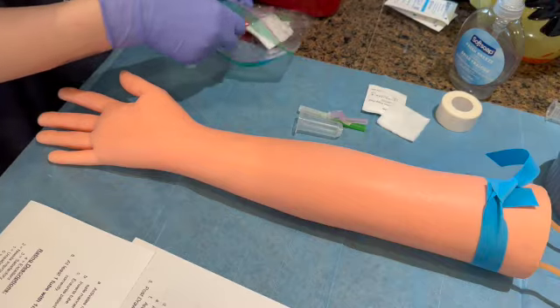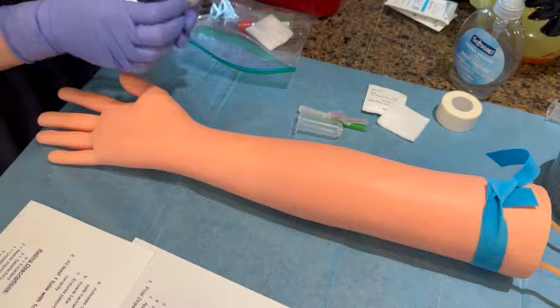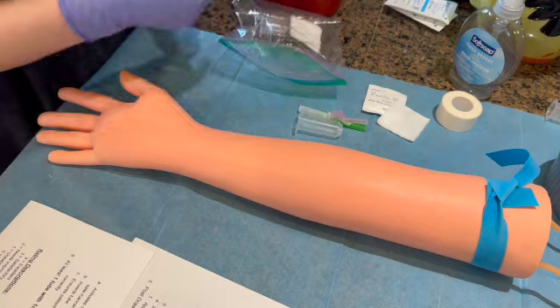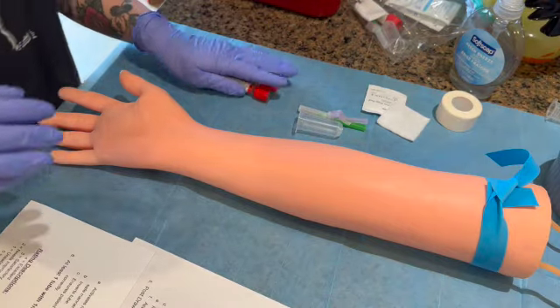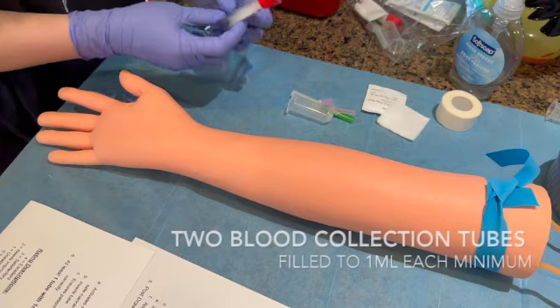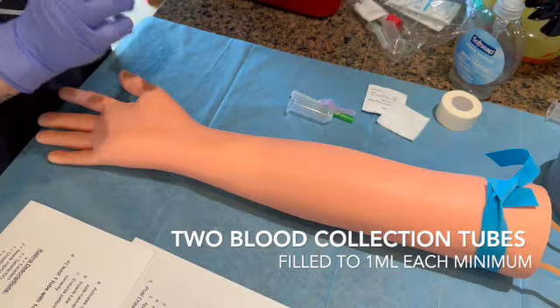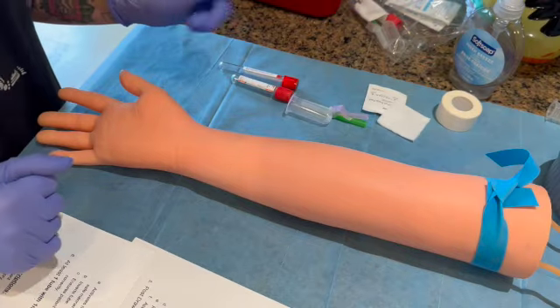And I know that for my straight needle, I need to draw 2 tubes of blood at 1 milliliter each. I'm going to actually grab one bigger and one smaller just for your guys' reference. And as another reminder, for the straight needle, you're going to do 2 separate venipunctures. Both venipunctures with a straight needle need to be 2 tubes of blood, both at 1 milliliter each. So minimum. Next process, we've already gotten number 3. We're maintaining our sterile technique.